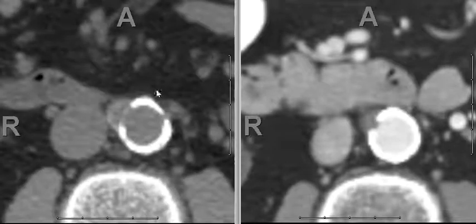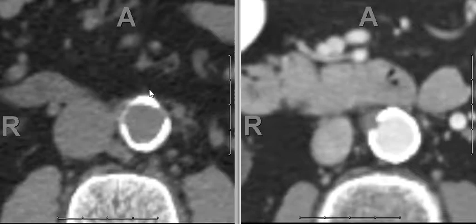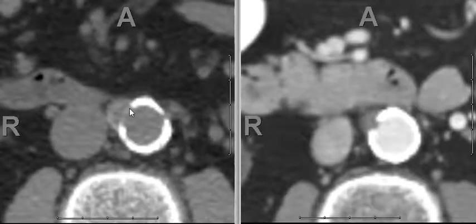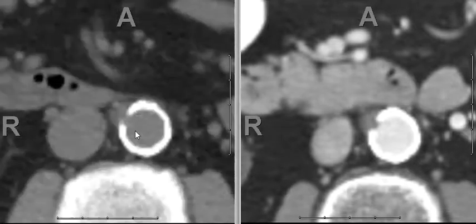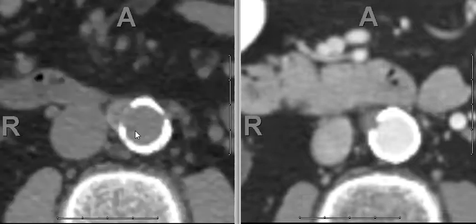This is a patient with bladder cancer, and this scan, which I'm scrolling right now, is from a year ago. You can see a defect in the atherosclerotic plaque or calcification in the aorta and a little bulge extending into the aortocaval space.